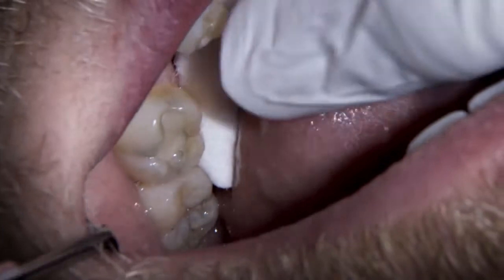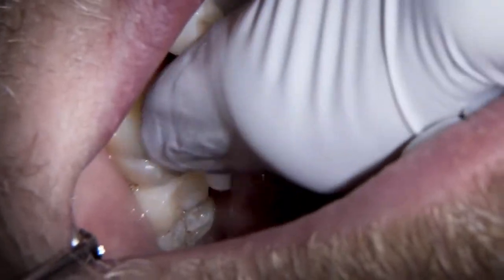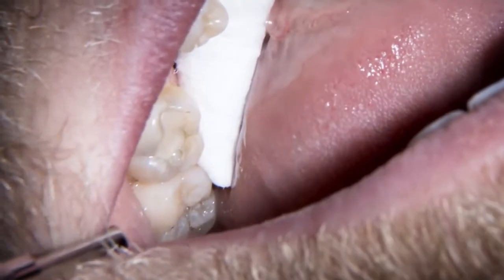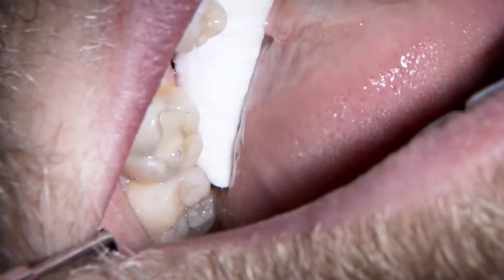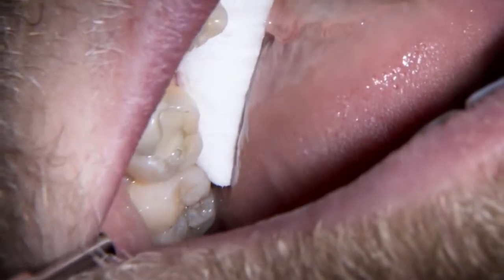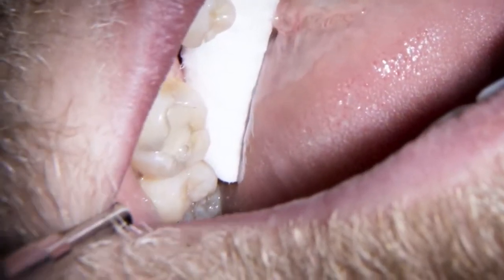We've got a composite that we're replacing here. We can see some grey shadowing all around the margins and spreading into some fracture lines mesially and buccally. On the bite wing we can see there's some area underneath the filling, so we're going to run that out. It's deep enough to warrant putting biodentine in there, and then we'll replace the filling.